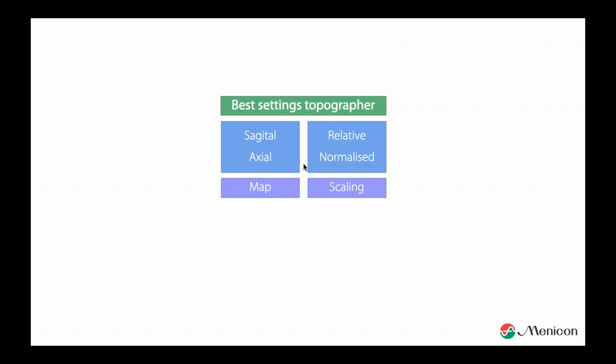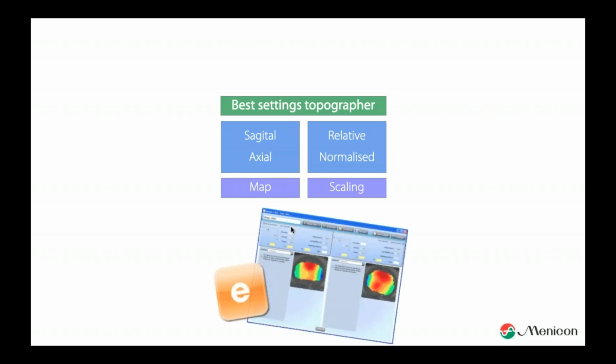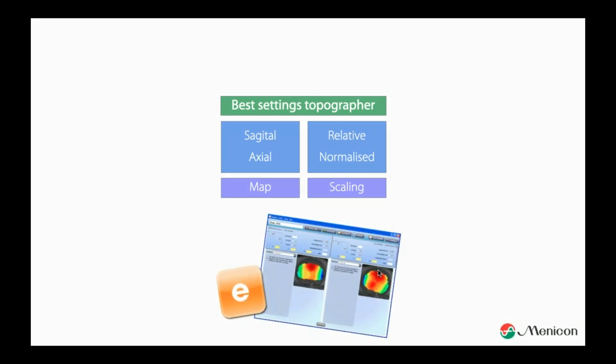But if you start in this, you have as much information as possible for yourself. These are the images we are using in EasyFit as well, our software. So if you see that your topography image is way off from what we show in EasyFit, probably it has something to do with your settings. Well, call your management subsidiary and ask them to help you solve that, and they can help you set the settings well in your topographer.